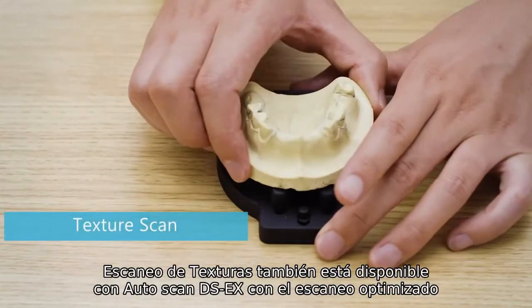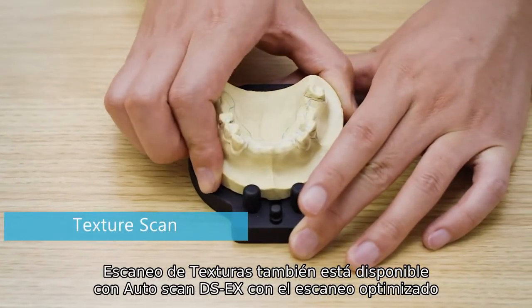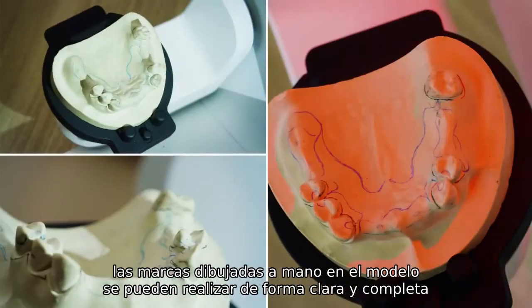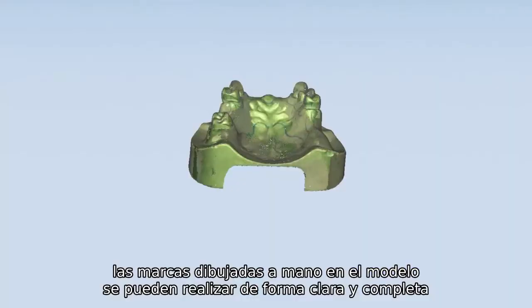Texture Scan is also available with Autoscan DS-EX. With the optimized scan path, the hand-drawn marks on the model can be clearly and fully acquired.